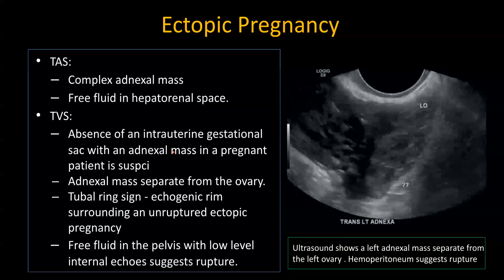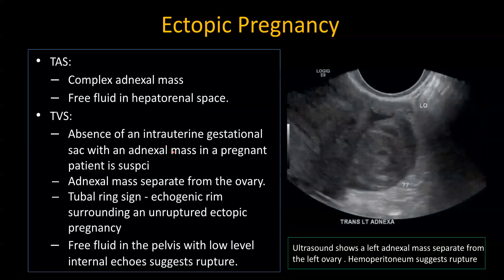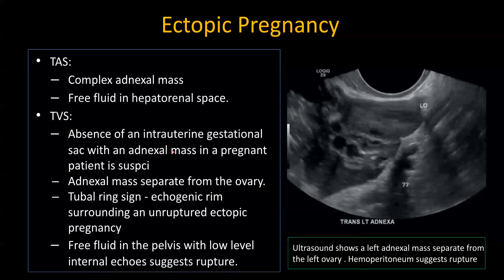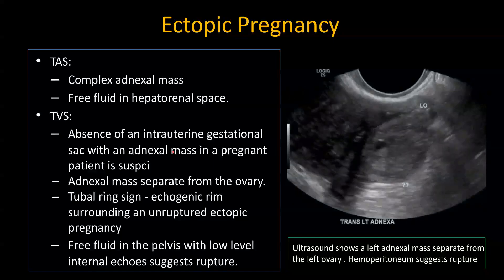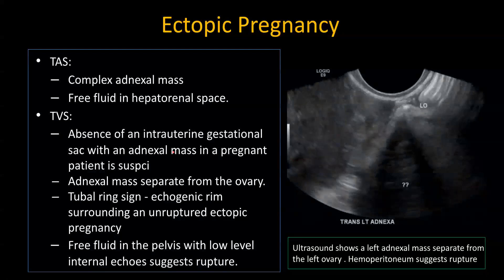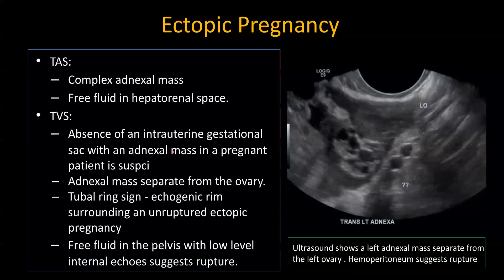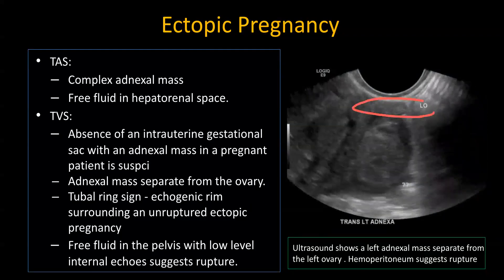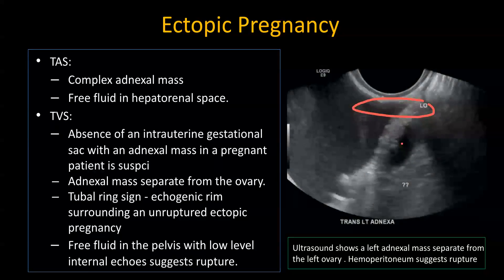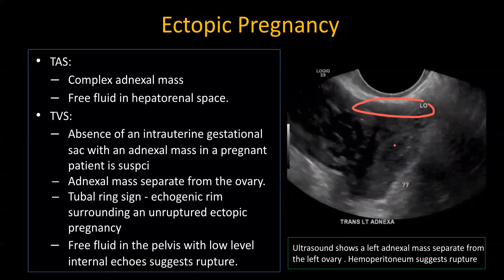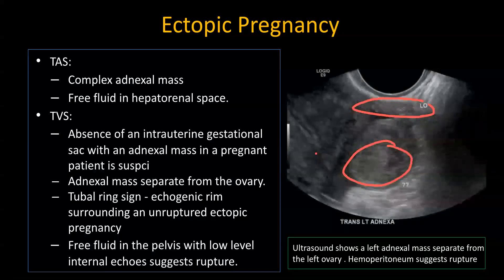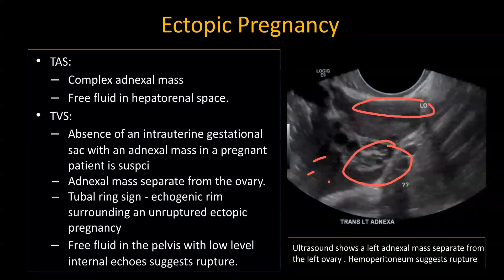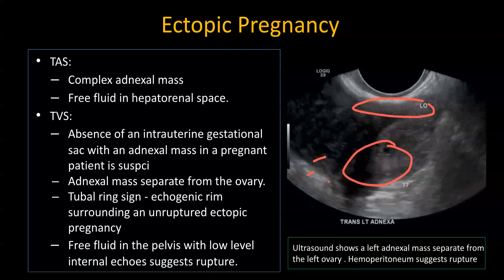Ectopic pregnancies were discussed in detail in our pelvic emergency talk — watch that if you haven't already. Briefly, if you don't see an intrauterine gestational sac and there is an adnexal mass separate from the ovary, that would suggest an ectopic pregnancy. In this case, the left ovary is displaced anteriorly, there is a separate left adnexal mass, and there is moderate volume hemoperitoneum evident by low-level internal echoes — this was a ruptured ectopic pregnancy.